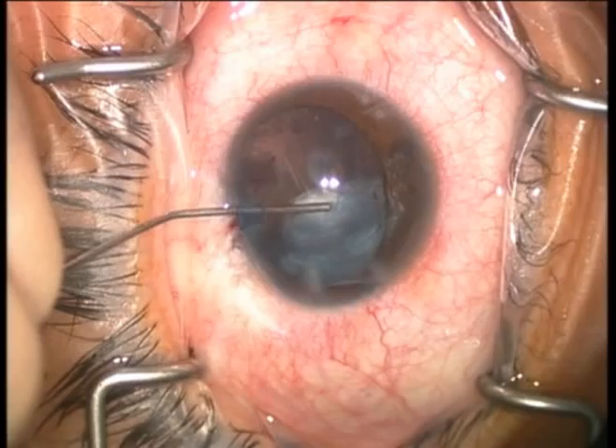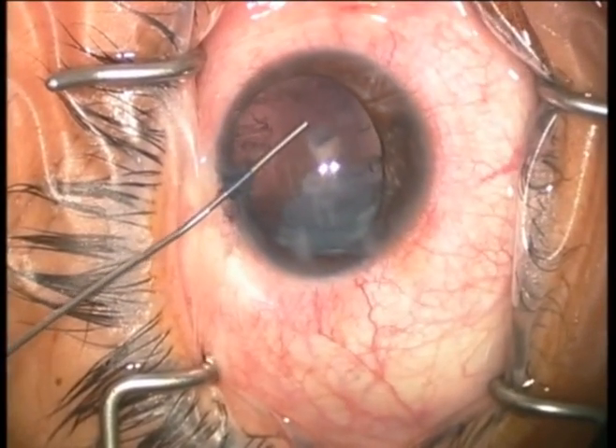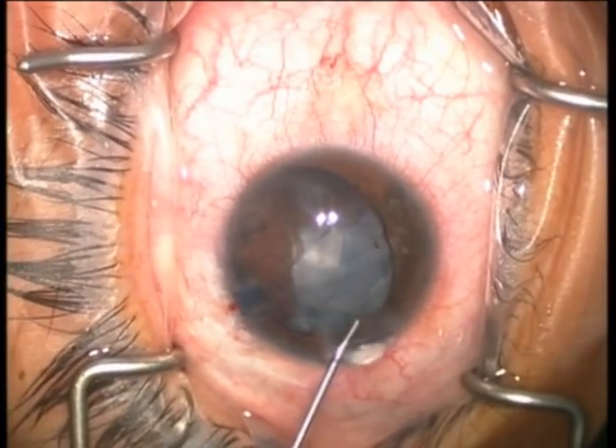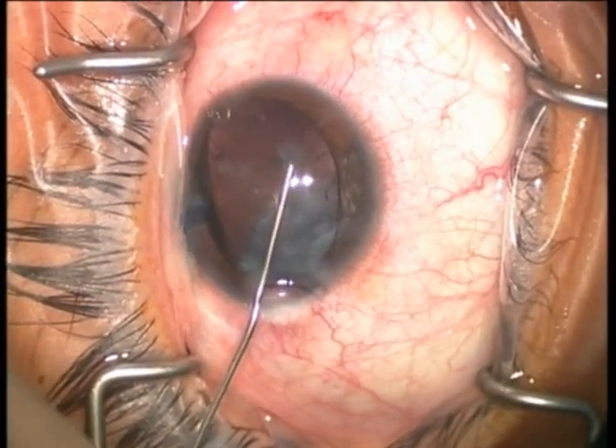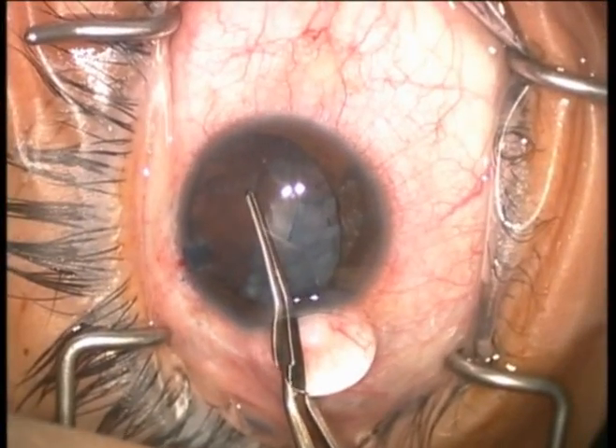We'll now inject more viscoelastic on top of the anterior lens capsule and in the anterior chamber. This allows complete stability of the anterior lens capsule and we can now perform a nice, round, well-centered capsulorexis in the anterior lens capsule.